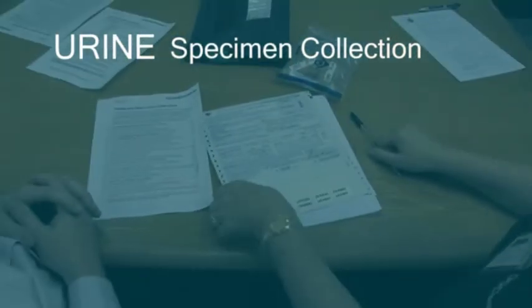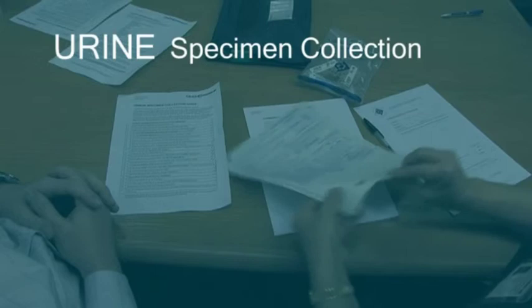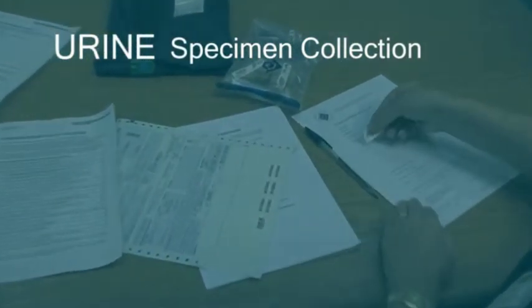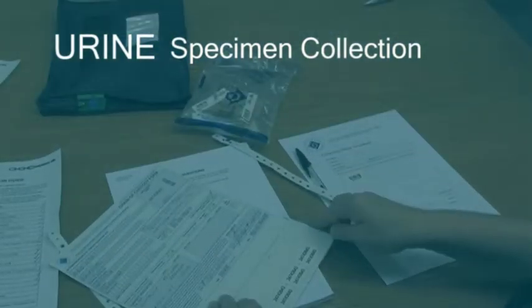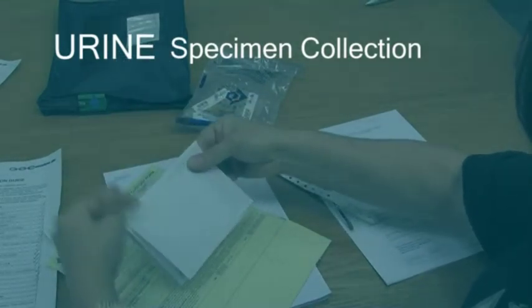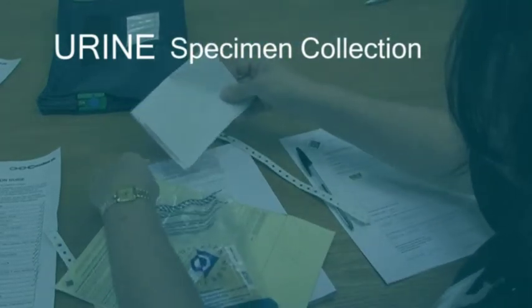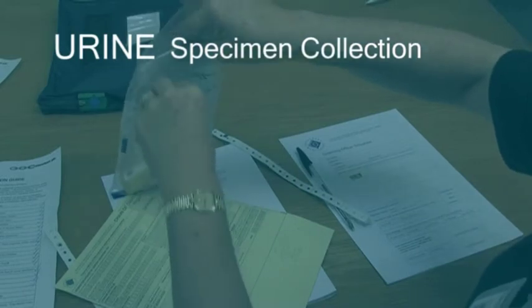Use the remaining small barcode labels according to your instructions. This may vary from customer to customer. Unused labels should be left on the form. The top white copy of the form should be folded into 4 so that the donor details are not visible. This copy is then placed in the second pocket of the chain of custody bag. Now seal the bag as shown.